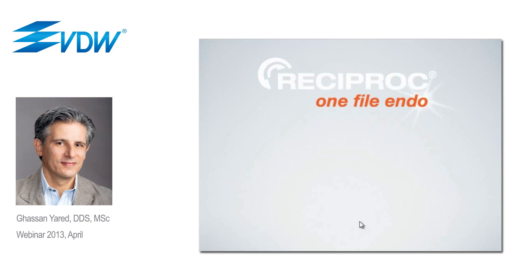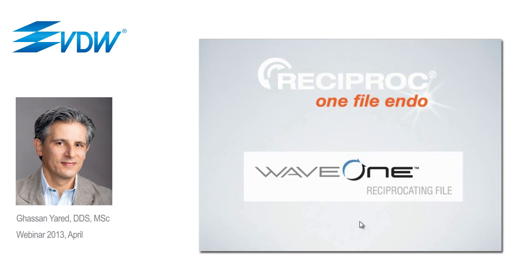And this is when I started working with Dentsply on instruments for single file reciprocation. And then we developed with Dentsply the Reciproc instrument and the WaveOne instrument. So both instruments are from Dentsply, and they are both single file reciprocating instruments. Now these instruments were much better than the F2 ProTaper.